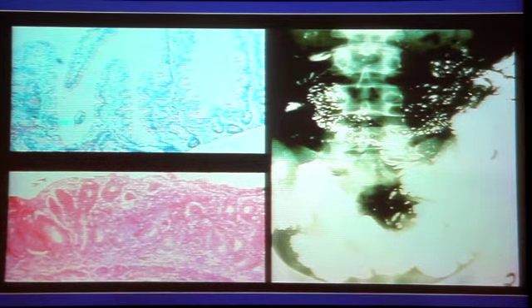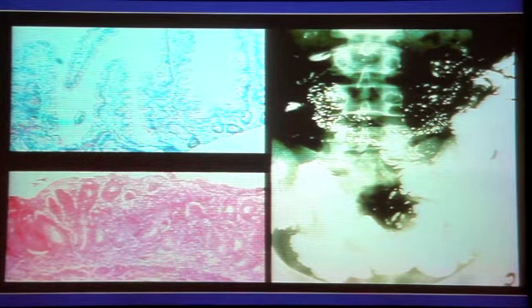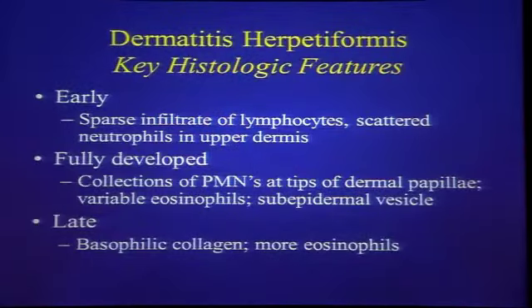And this is a small bowel study which shows this rapid transit of the barium here. This is just a few moments after they drank this. It just went right through into their large intestine.